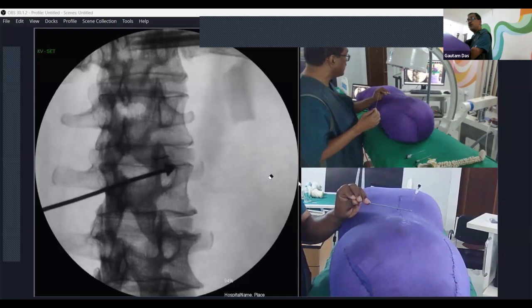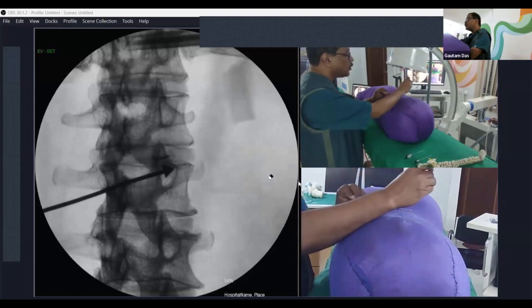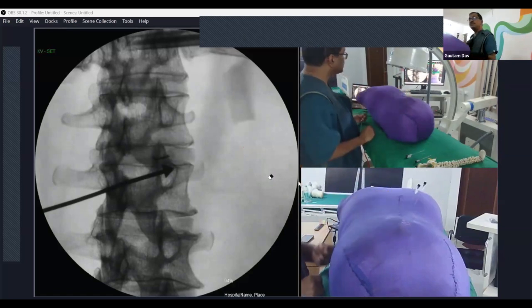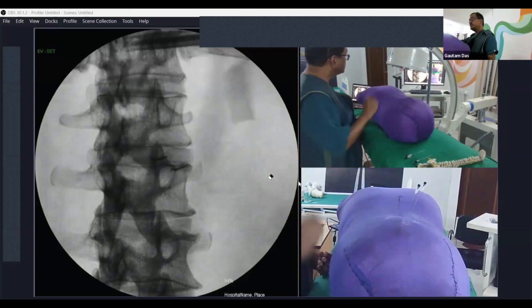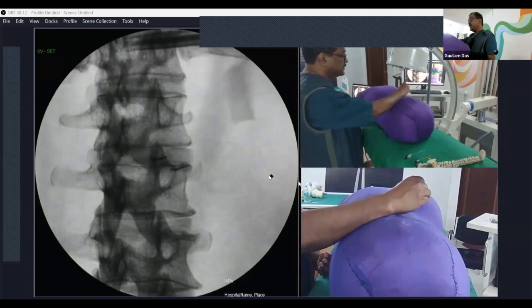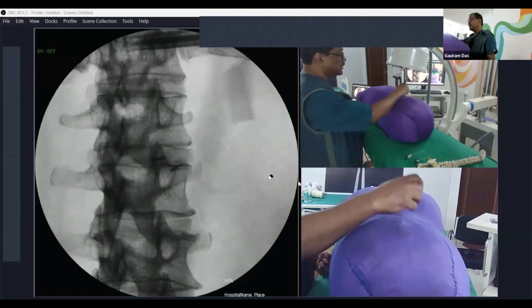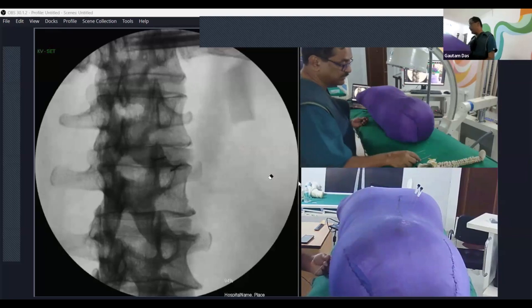So now the next procedure is your medial branch. Medial branch block is at the junction of the superior articular process and the transverse process, also known as the eye of the Scottish dog. Again, in tunnel vision, I'll be hitting the bone there. This is again tunnel vision, coaxial view. I'm hitting bone there. This is for the medial branch.